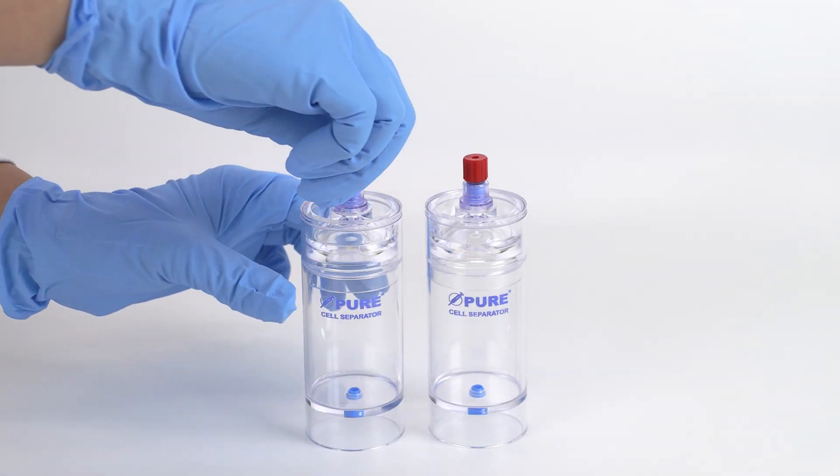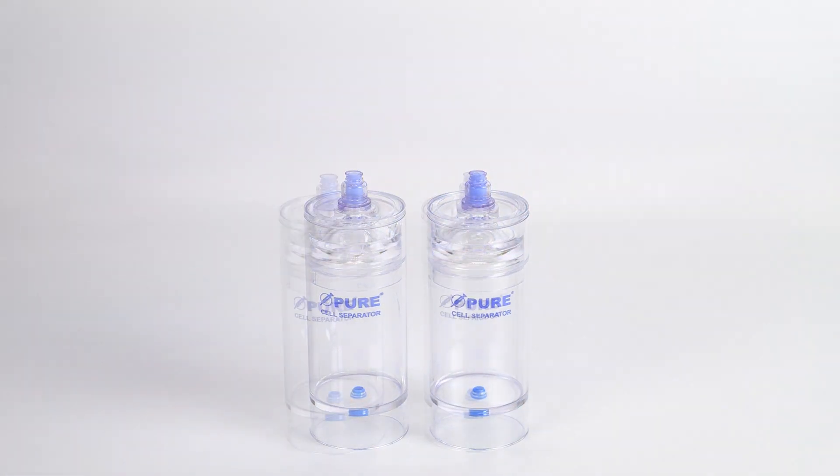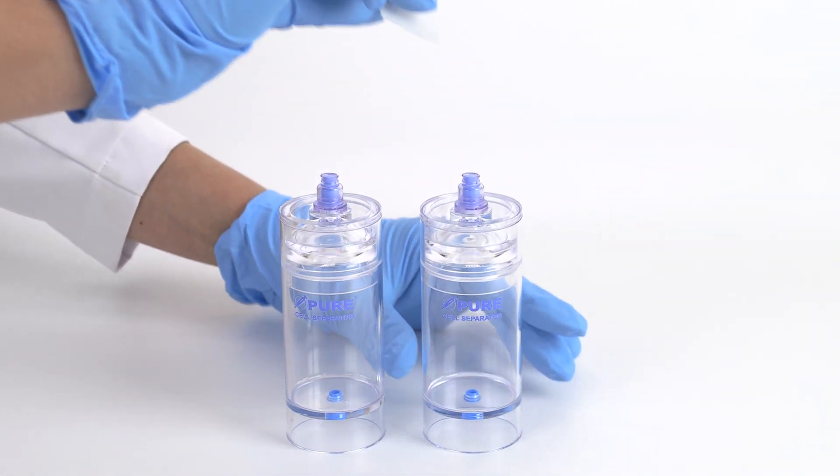To begin, remove the red cap from the needleless valve port of each separator device. Swab each port with sterile alcohol before and after accessing with a sterile syringe or cap.